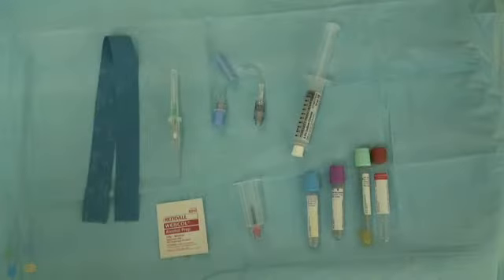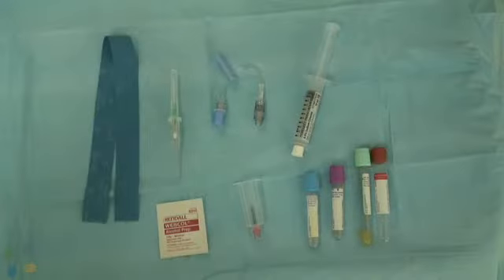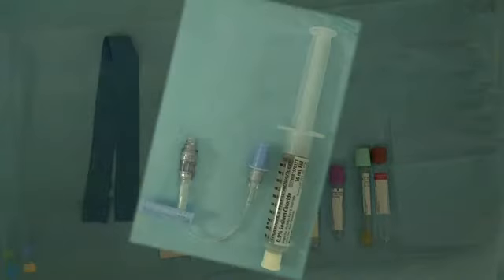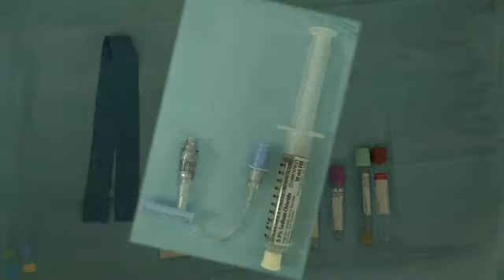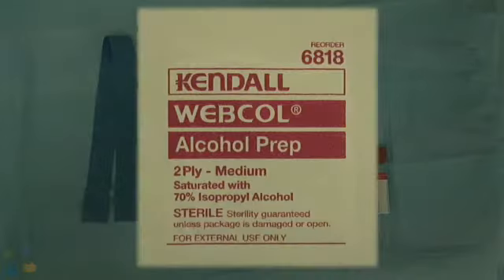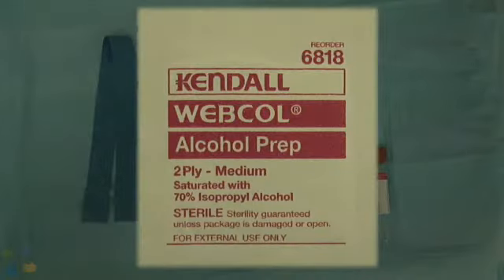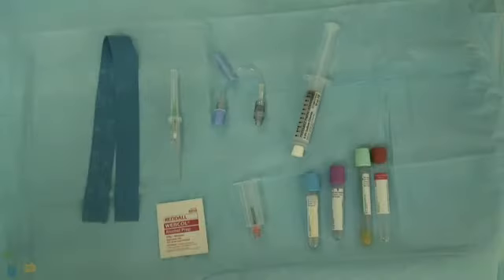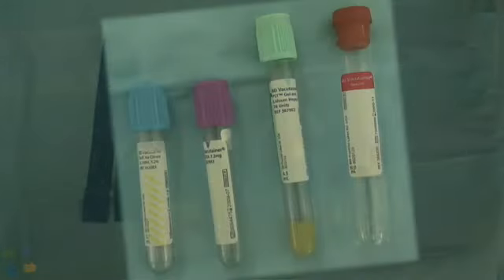Before starting your IV, collect all the supplies you will need. This will include the needle and catheter, a tourniquet, a saline lock and saline flush, an antiseptic swab, a blood transfer device, and blood tubes.